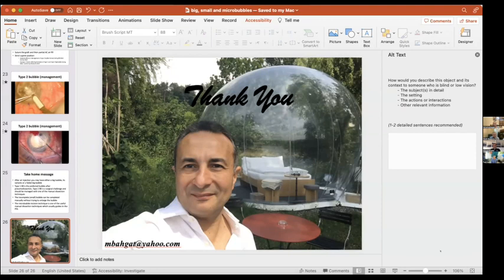All right. Well, I think everything has been very, very clear. And Professor Bahgat summarized the situation very well, saying what is desirable, what is not desirable, and how to rescue situations using the microbubble technique as manual dissection.